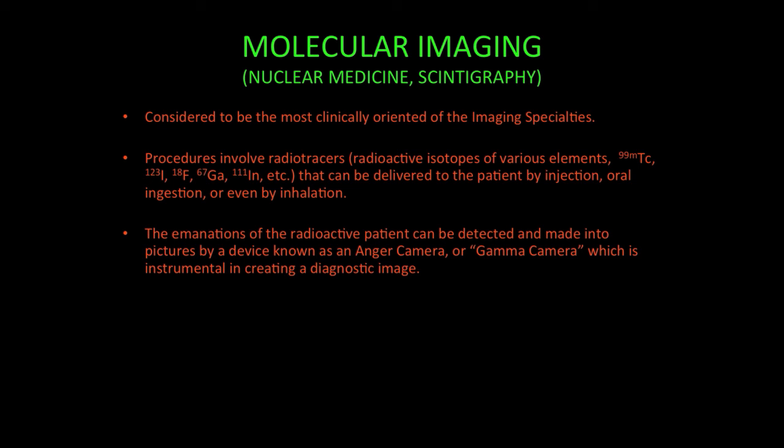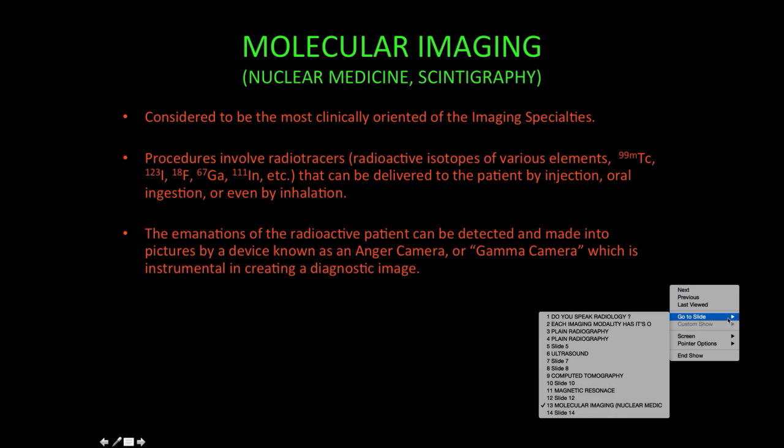The emanation of this radioactive material from the patient is detected and recorded by a device which is known as an Anger camera or a gamma camera. And this then produces the anatomical diagnostic image.